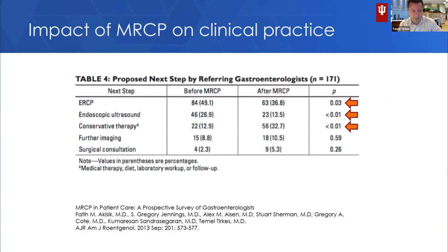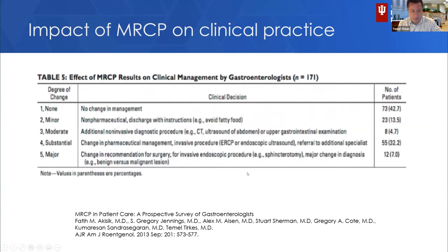We did a study at IU asking the gastroenterologists, hey, is MRCP really helping you or not? And it turns out it really helps the gastroenterologist, as you can see in these results. Before and after MRCP, there was about 20% less ERCP performed, about half the endoscopic ultrasound was performed after reviewing the MRCP, and conservative therapy almost tripled. So we really changed the management of these patients.